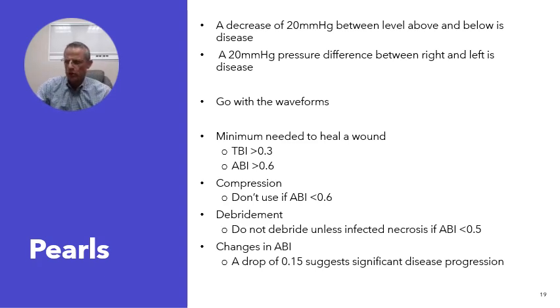And if that's the only change that you're seeing, that is potentially symptomatic for that patient and should give you a heightened threshold for getting a more formal study. Always go with your waveforms. Those are going to be more diagnostic than just the number itself.